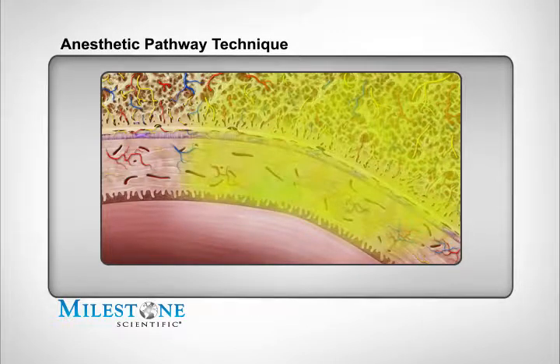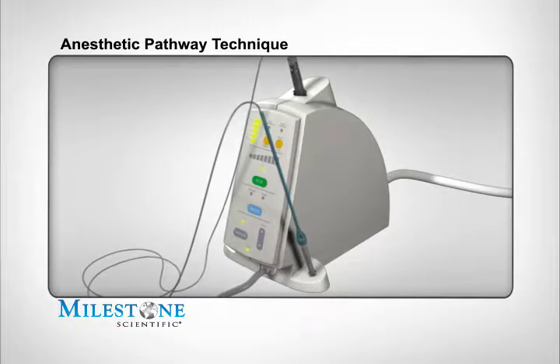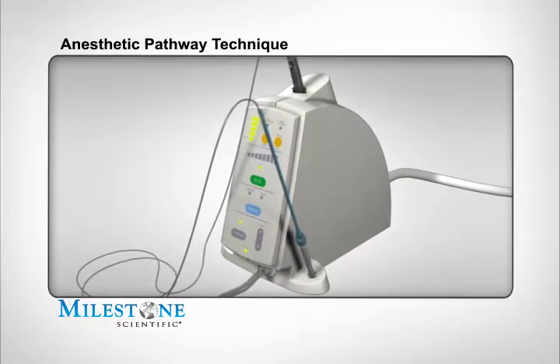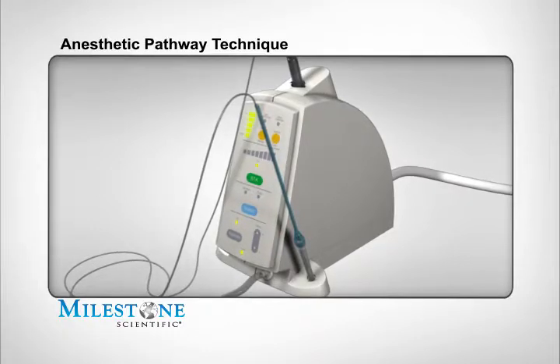You have just reviewed the critical steps of the pre-puncture and anesthetic pathway techniques. The combination of the technique and the technology of the STA system allows one to perform a painless palatal injection. The STA system will empower you to improve all your current dental injection techniques.